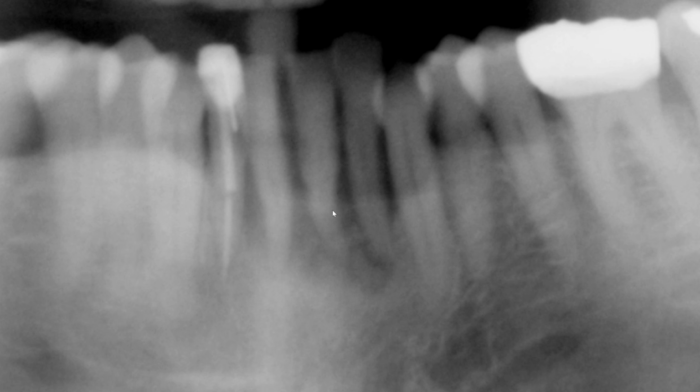radiograph. But if we look down below, we do see a mixed density lesion here, kind of at the apex and in between the roots of these two incisors. So there's an amorphous opacity with radiolucency surrounding the area. And while it is difficult to interpret, perhaps there may be something going on in this area as well, maybe even here, right? But it's hard to say. So we want to better evaluate this area by taking a periapical radiograph. So let's take a periapical radiograph of this area.